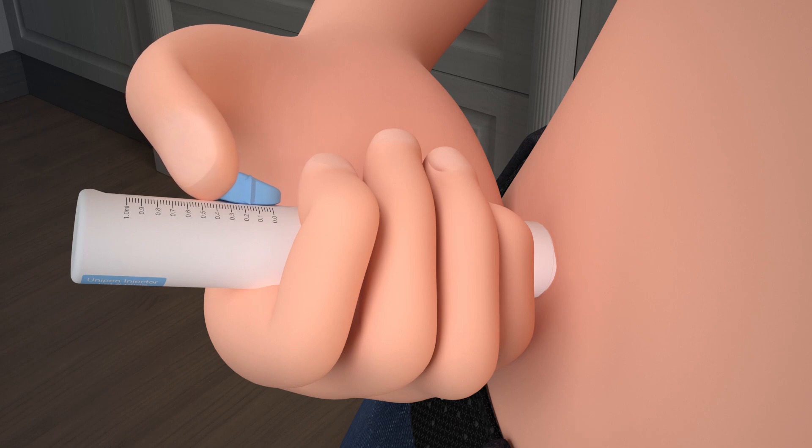As you do this, watch the indicator arrows on the sides of the plunger. Once the indicator arrows are pointing to the bottom of the scale, your injection is complete.